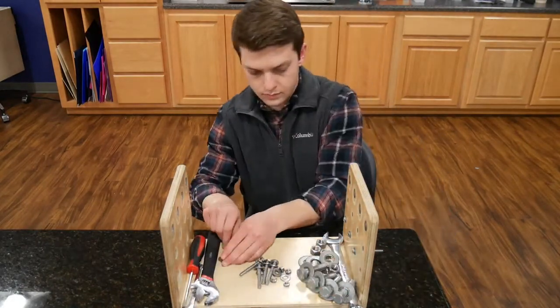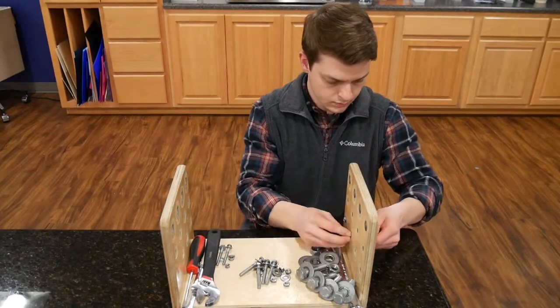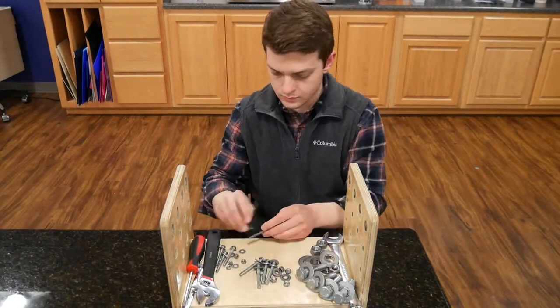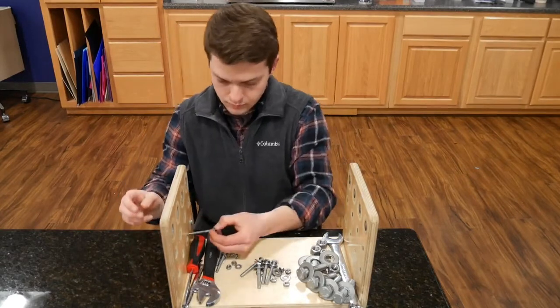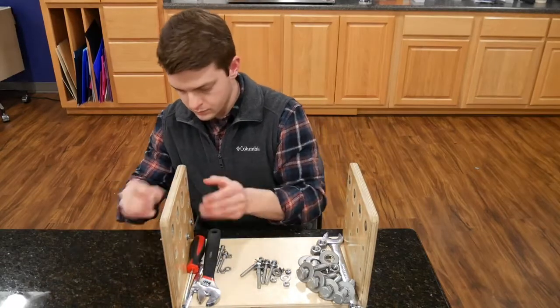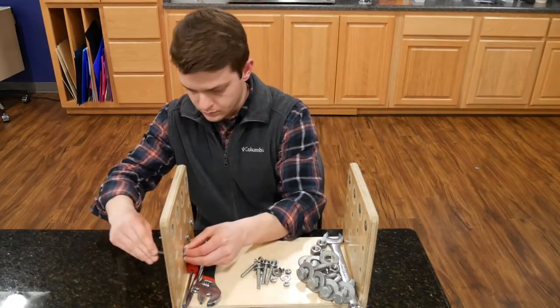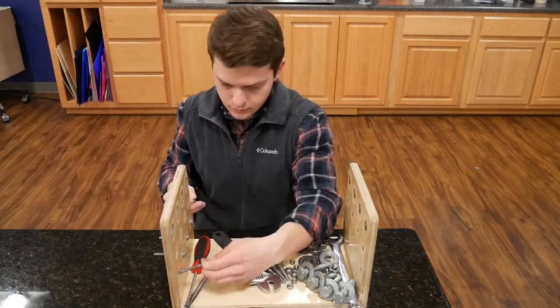When I go to reassemble, I'm going to start on the bottom row, working my way upward, and make sure to flip the nuts and bolts around — you can see how they're facing the opposite direction. I'll assemble all these with my hands first, hand tighten them, and then come back through and tool tighten each one. Each row needs to be tool tightened before the examinee moves on to the next row.